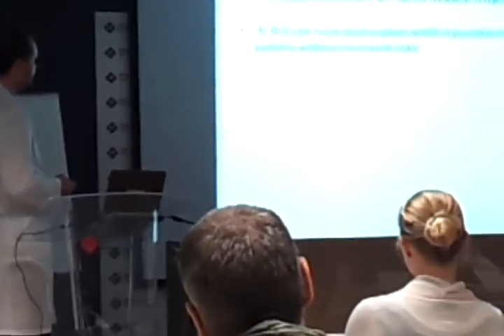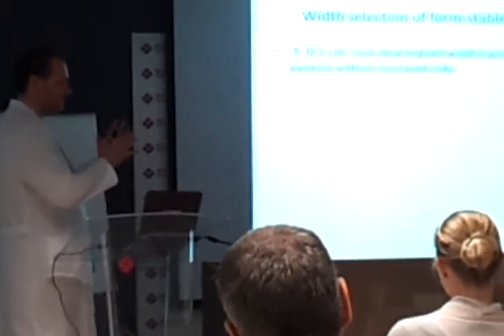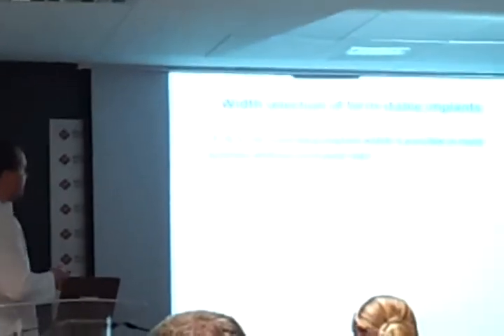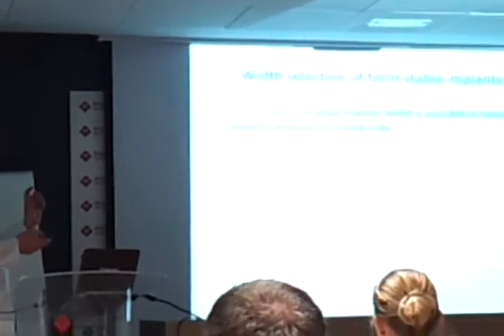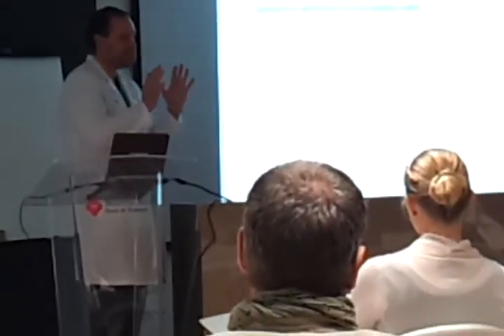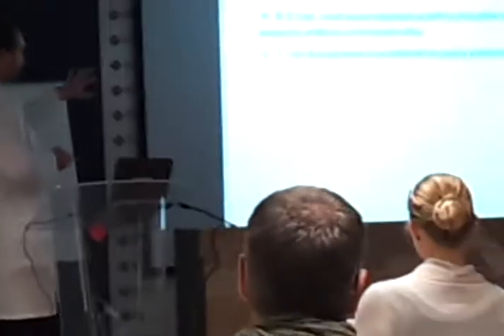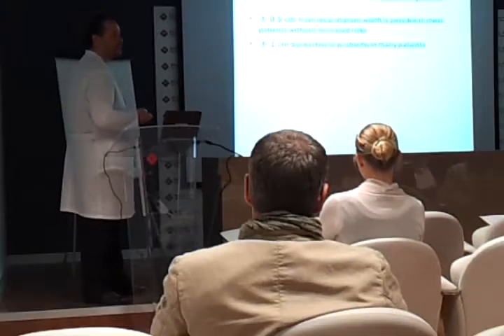If we select in a range of 0.5 difference from what we have selected in the office, well, this is possible without increase of risk. We can play with 0.5 difference in width of the implant without any problem, no risk. If we play with 1 centimeter difference, we are borderline for problems in many patients.